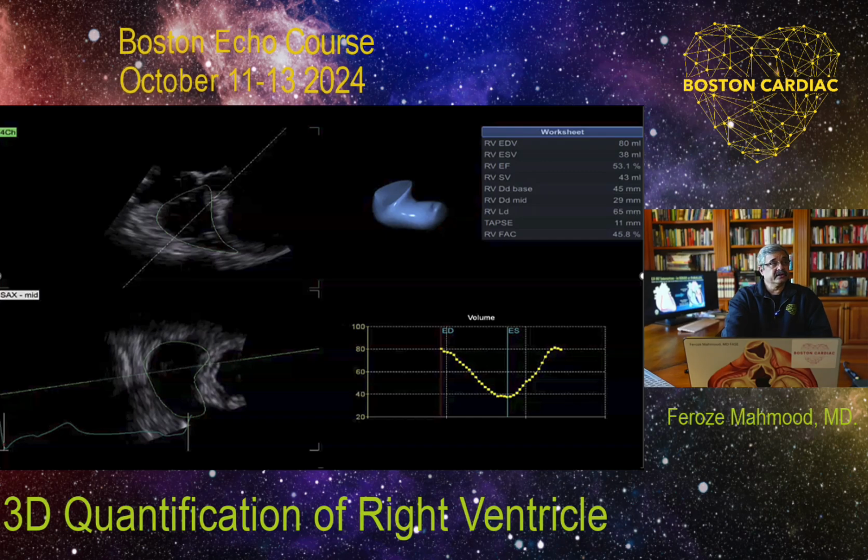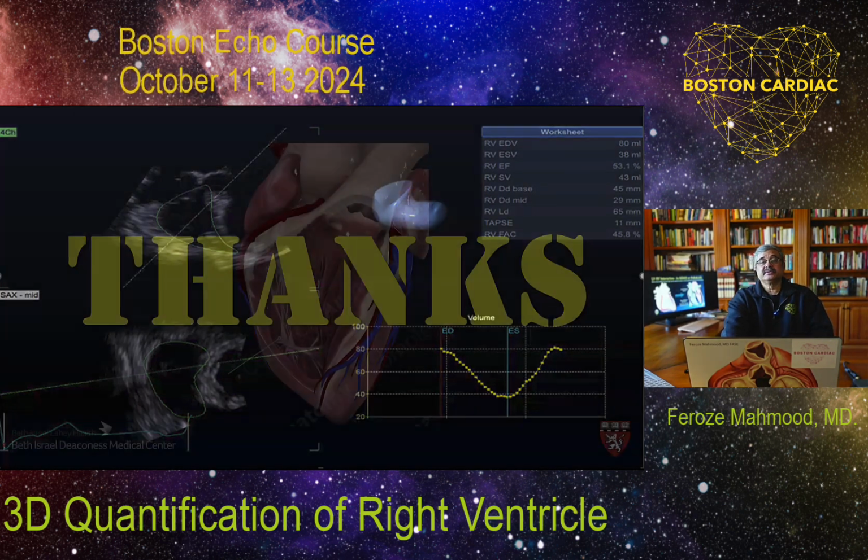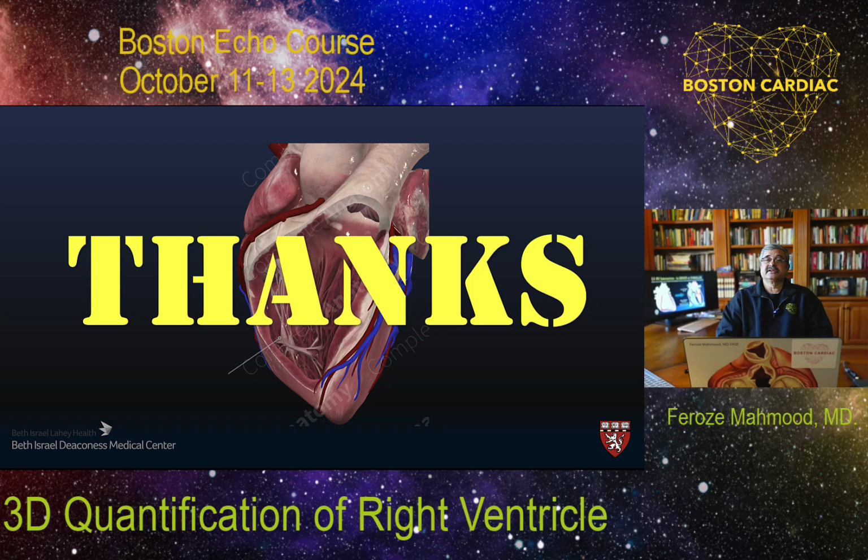So at the end of the day, there are multiple other vendors who are coming out with similar techniques for assessing the right ventricle, because the impact of right ventricular dysfunction on outcome is being appreciated, and therefore this is a very exciting new area of research that we have started participating in to improve patient care and outcomes. I hope you like this lecture.